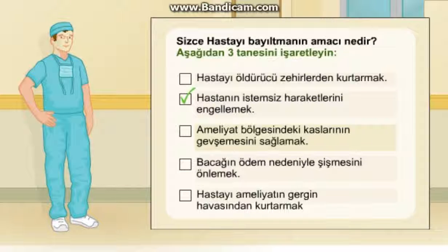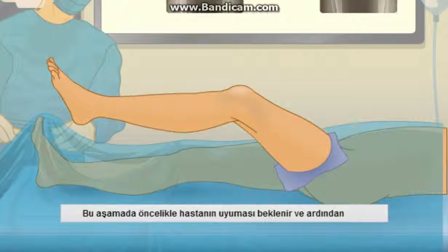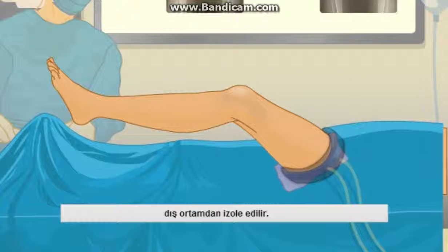Good work. Great. Fantastic. After the patient is unconscious, and before the first incision is made, we need to establish a sterile field around the surgical area. A series of sterile drapes isolates the surgical field from the rest of the patient's body.